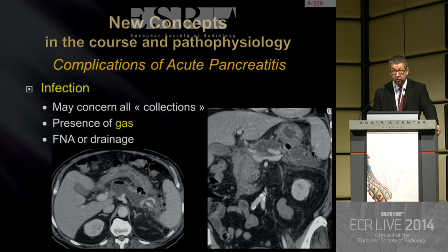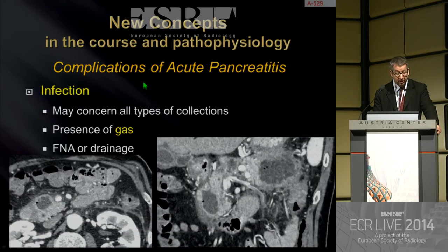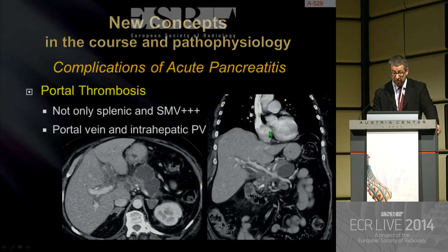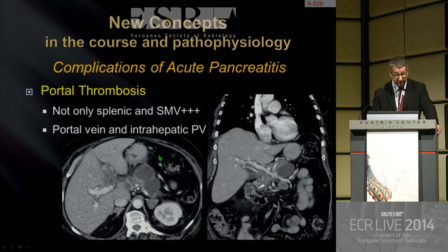Regarding complications of acute pancreatitis, infection may concern all collections. Presence of gas is the main CT finding indicating infection. Fine needle aspiration or drainage may also confirm the diagnosis of infected pancreatitis. In this case, you can see intrapancreatic ANC with clearly gas in the collection in the head of the pancreas — clearly infected acute necrotic collections. Portal thrombosis is a common situation in acute pancreatitis, not only for splenic and superior mesenteric veins but also in intrahepatic portal veins.